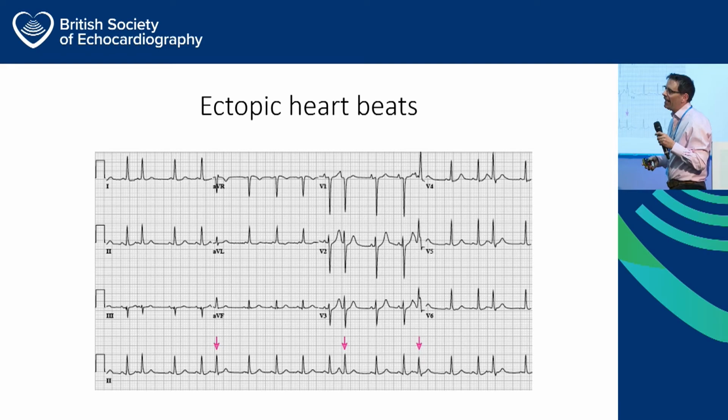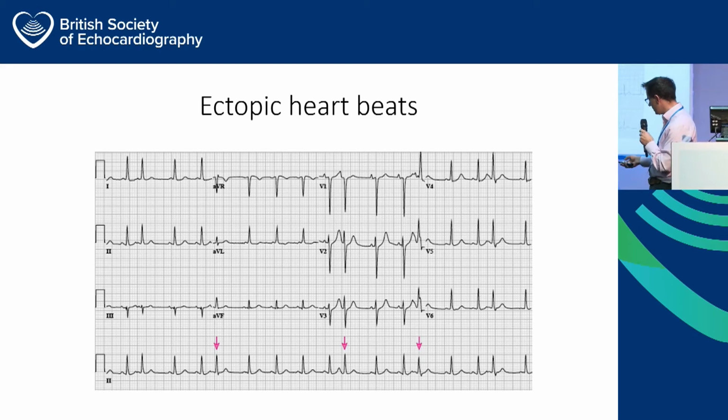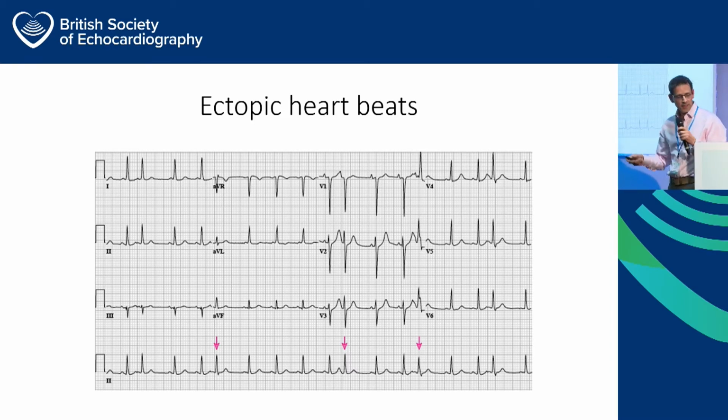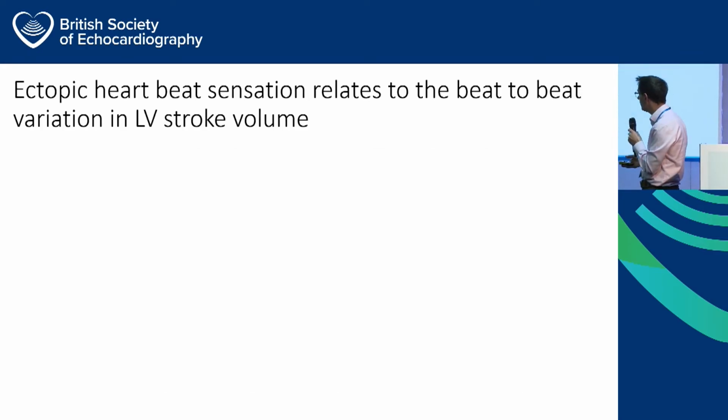But it has just made these things so much more prevalent, and a pseudo-understanding of it, if you like, so much more prevalent out there. And you need to have some tools to cope with it. So here we've got, I'll move this round. We've got our ectopic heartbeats, and they are supraventricular ectopics, so they match the QRS appearance of a sinus beat. And there is this classic pattern to them, which I'll go through in the next slide, and we'll talk about the symptoms you get with it.